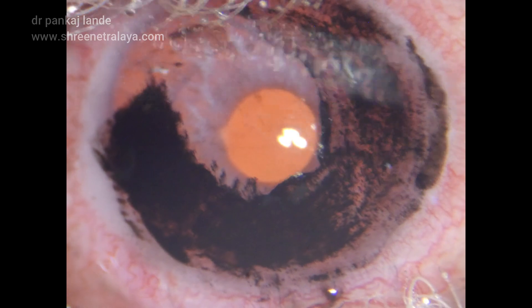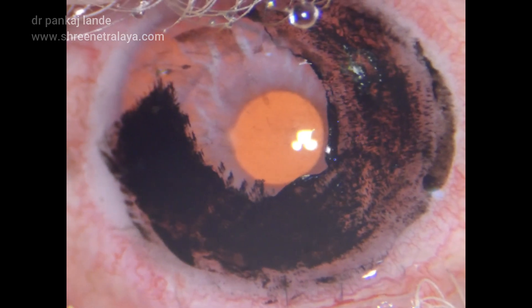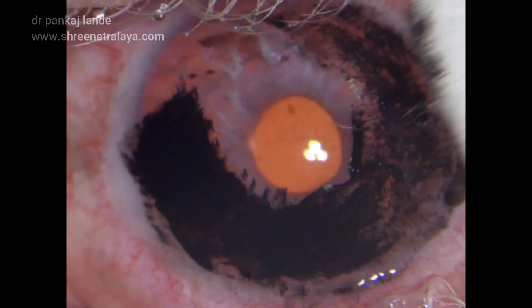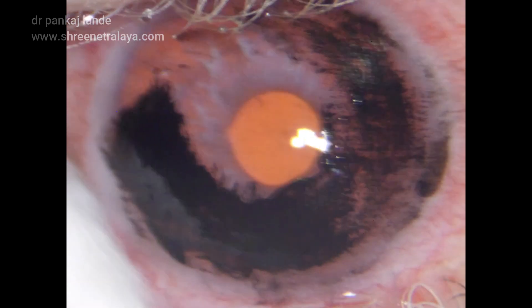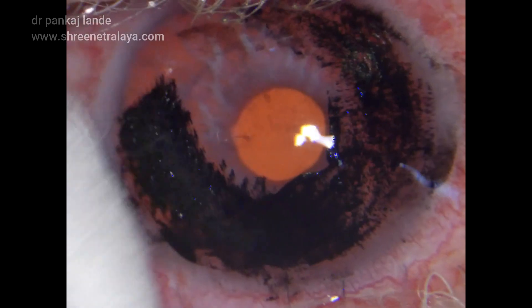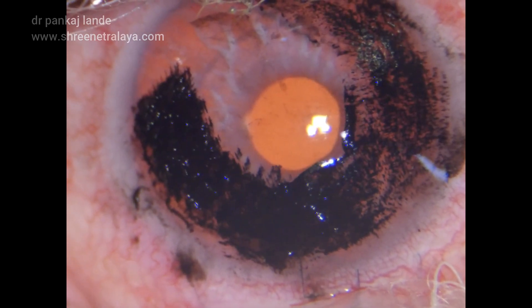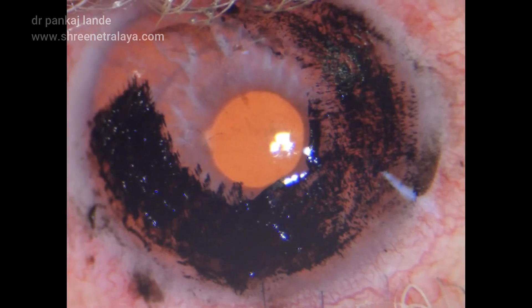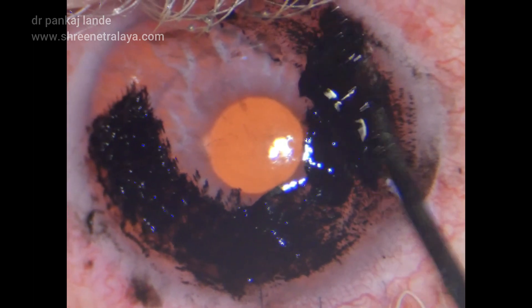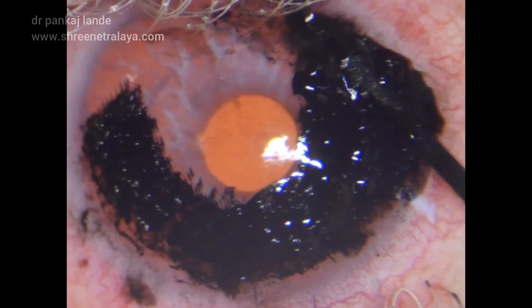I am repeating my steps of performing the tattoo, washing it with saline, and checking how much has taken up. I am very conscious about not overdoing my treatment. I have taken a lot of time to perform this and have cut short the video to save some time.